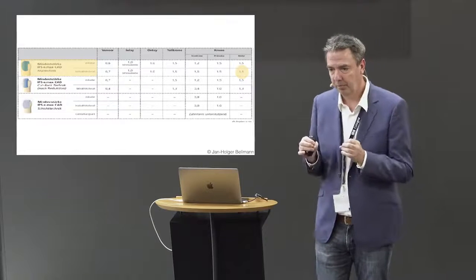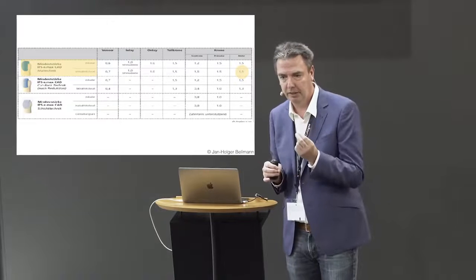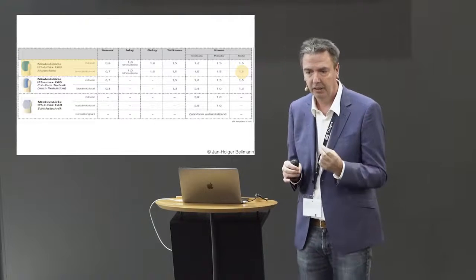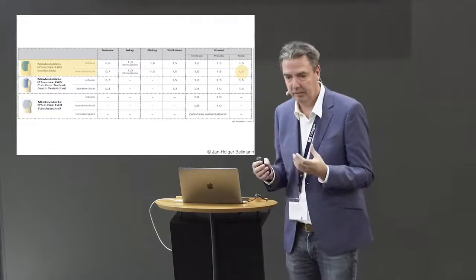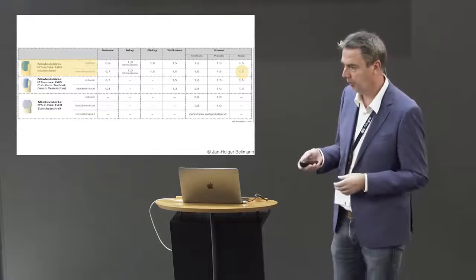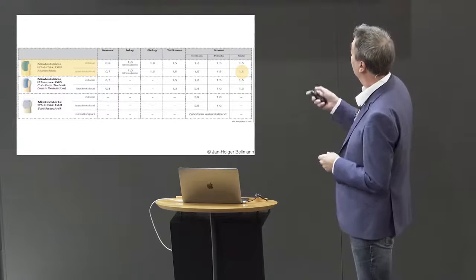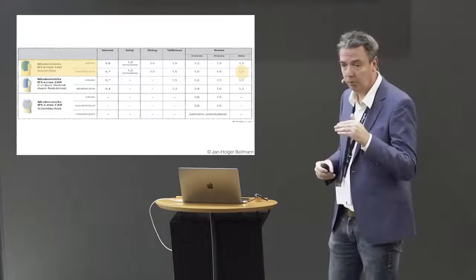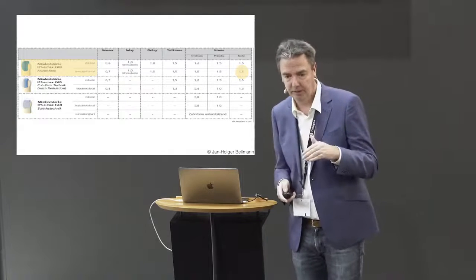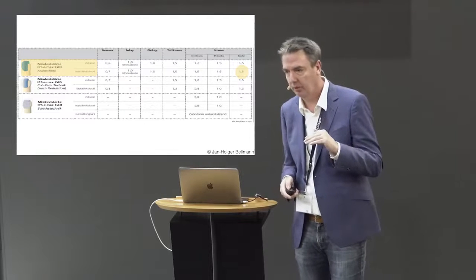Always keep in mind the recommendation of the manufacturers of the material. How much space do you have to create to get a long-lasting result? Because otherwise you will see fracture problems over the period of time. For e.max, we have a minimum thickness on a molar of 1.5 millimeter. And if you don't follow these rules, you will directly run into problems.